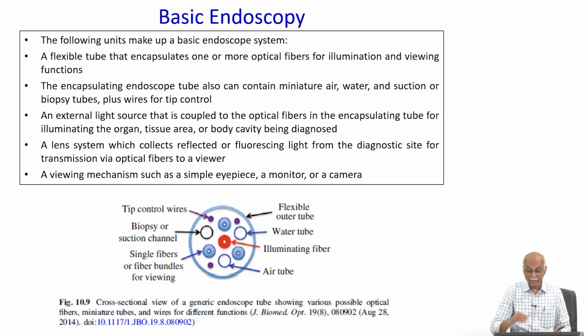But the advantage is you do not have to remove the tissue sample. You can image the tissue without any tissue biopsy, you can still do an optical approach of biopsy and observe what the characteristics of those tissues are.